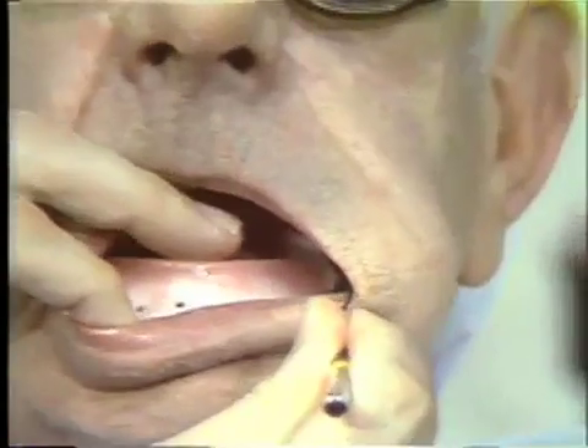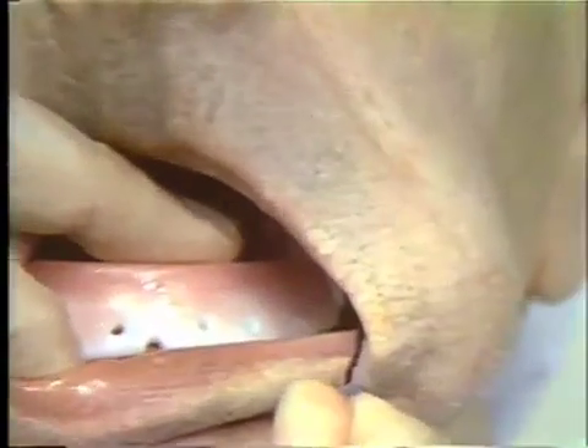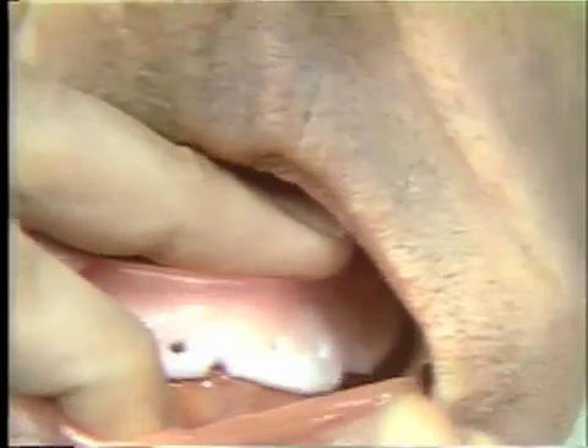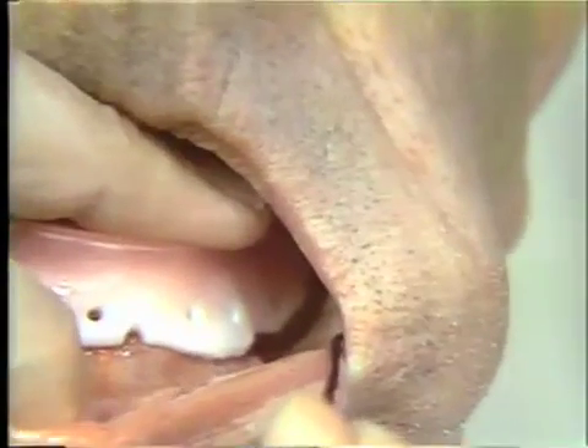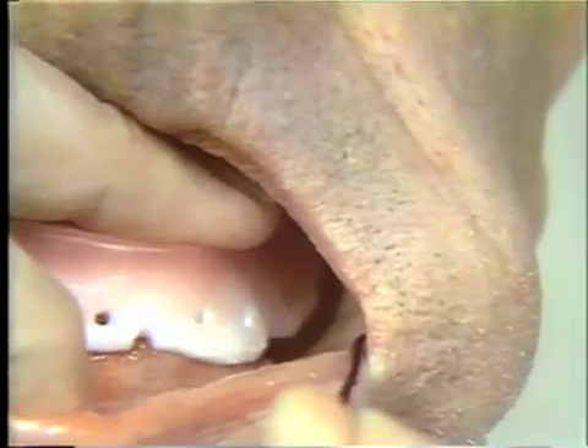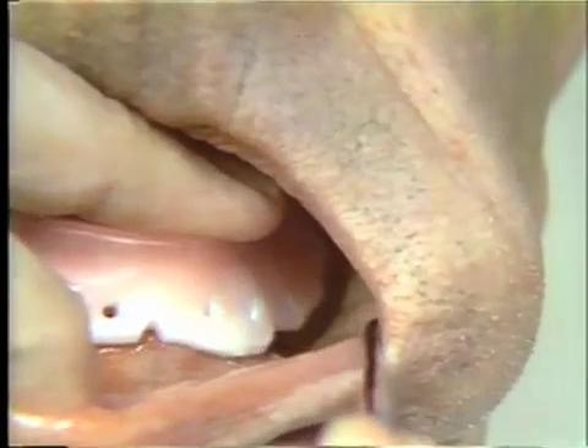Once this has been completed you can inspect the extension you have provided to that flange with compound. Reflecting the cheek down, you can see that we have indeed extended the flange. The compound is filling the sulcus depth and we have extended the flange to its proper dimension and its proper length.